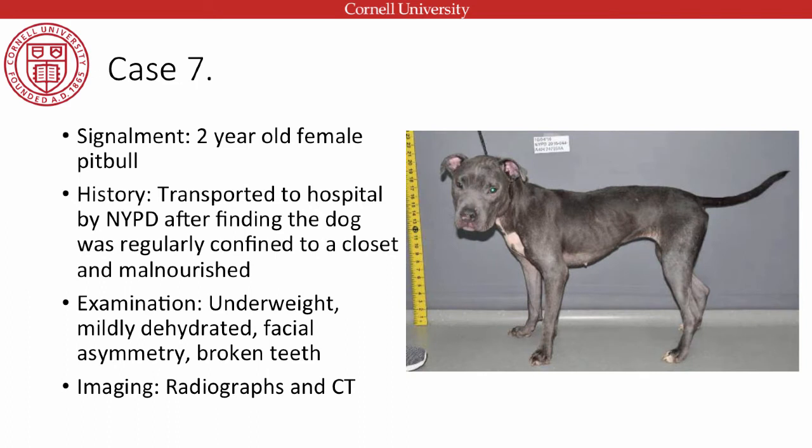Okay, moving on to this girl. So she's a 2-year-old female pit bull. There was a report that this dog was being kept in a closet and was malnourished, and she was brought in by the New York Police Department and she was picked up.